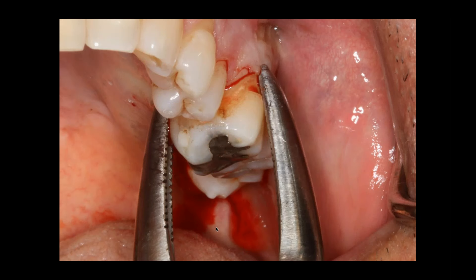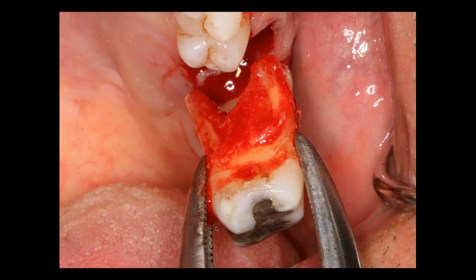I will then take my tooth delivery instrument. And you can see we took a very difficult tooth out in a very short amount of time, very atraumatically to the hard tissue, very atraumatically to the doctor, and very atraumatically to the patient.